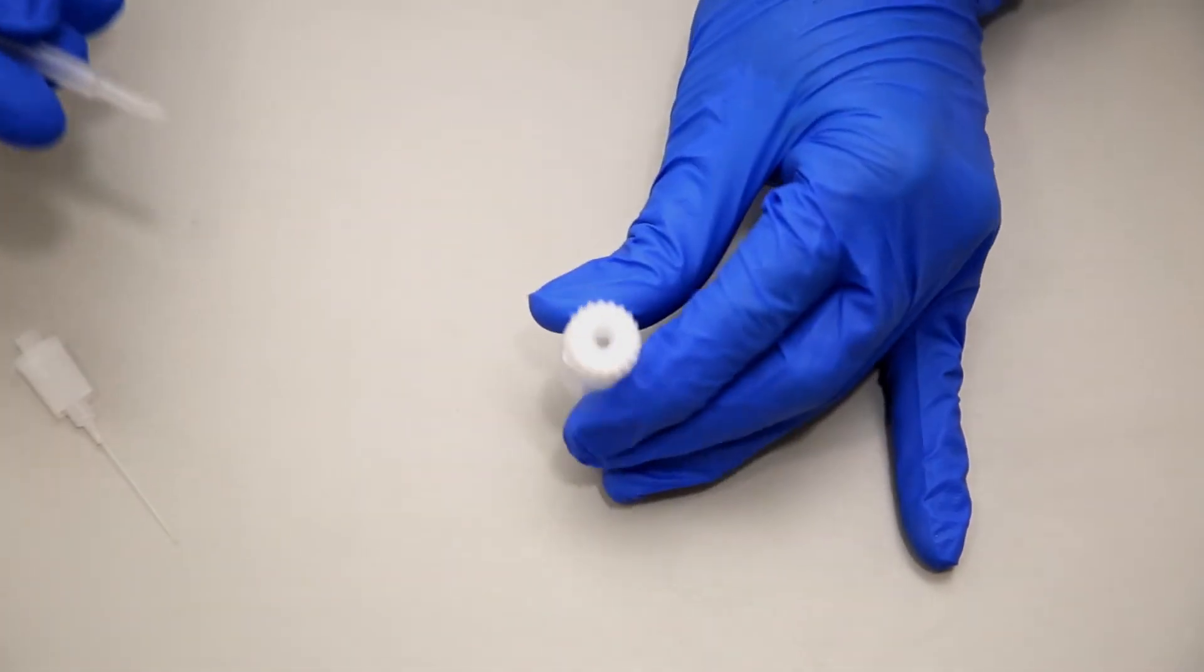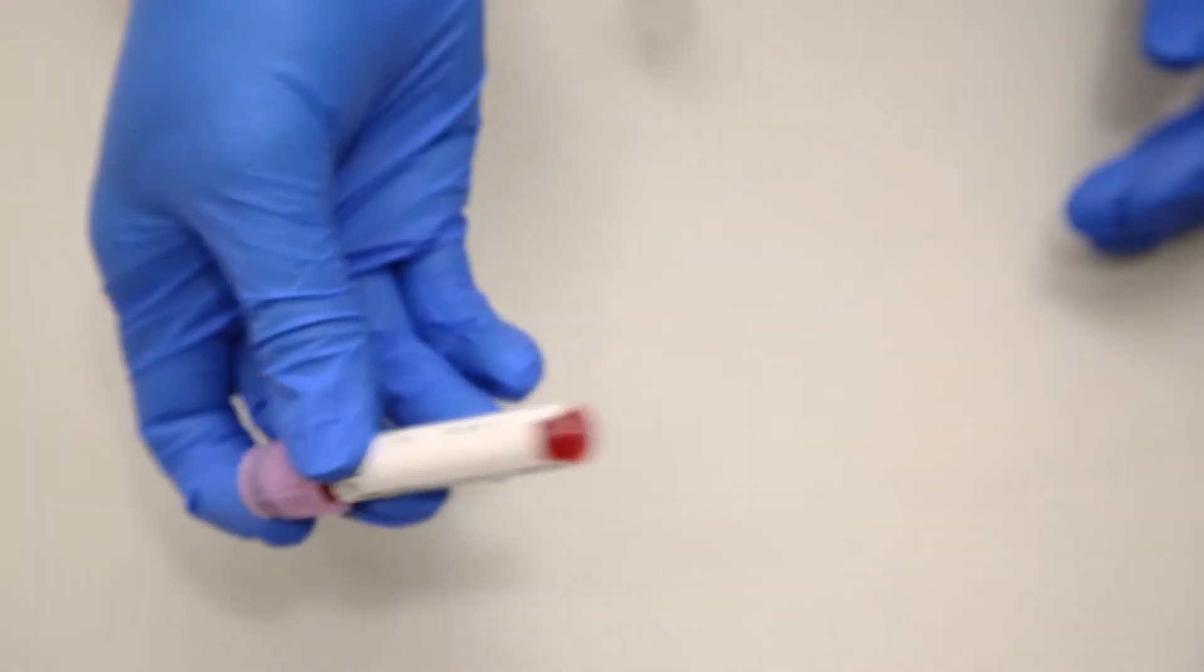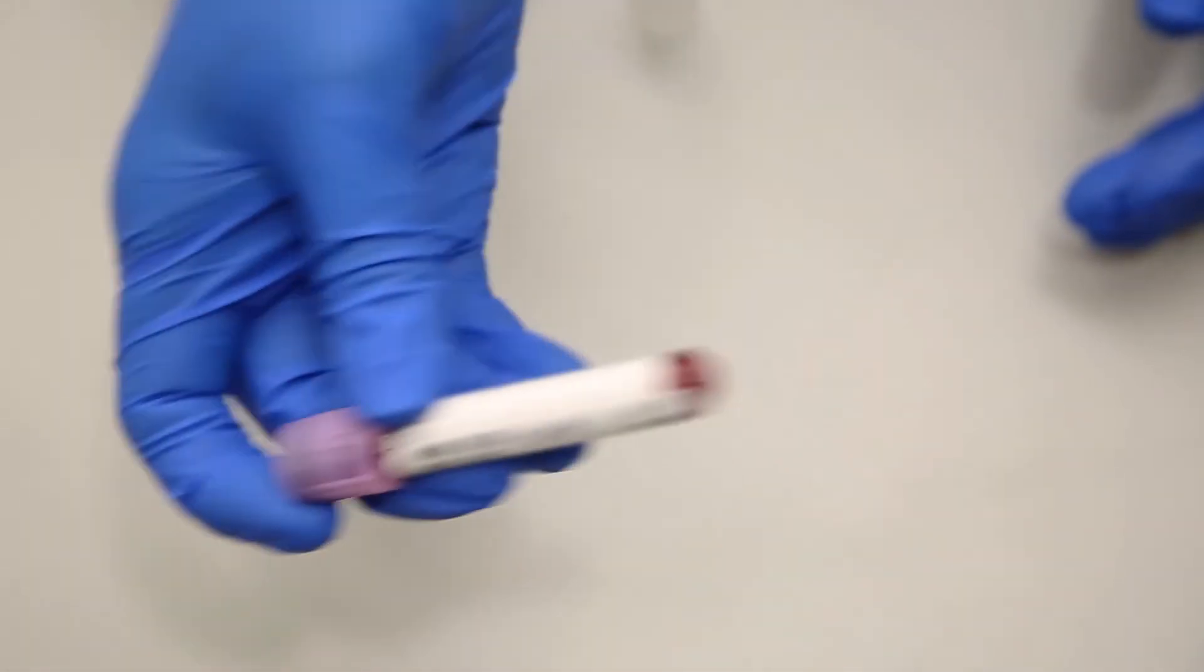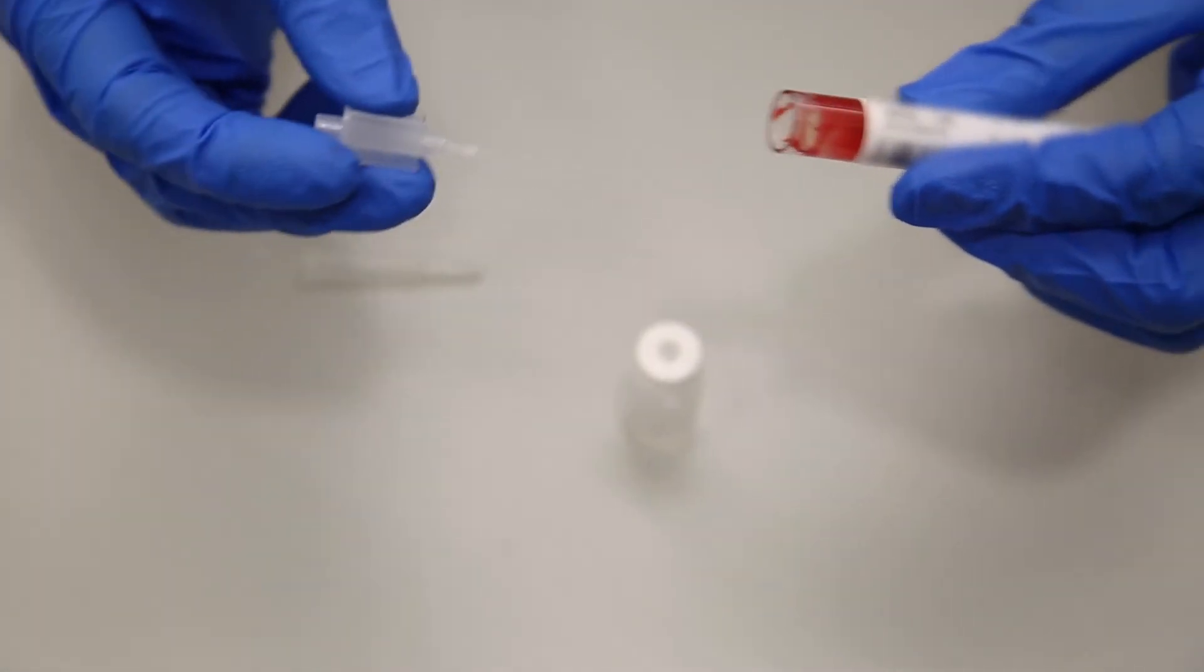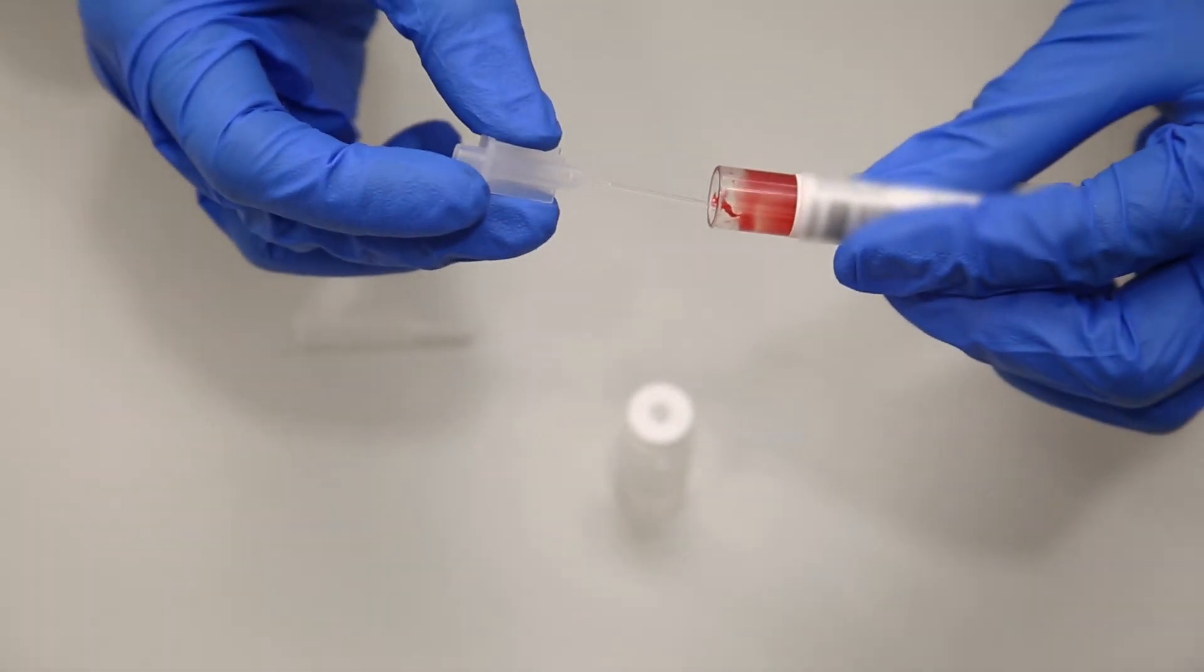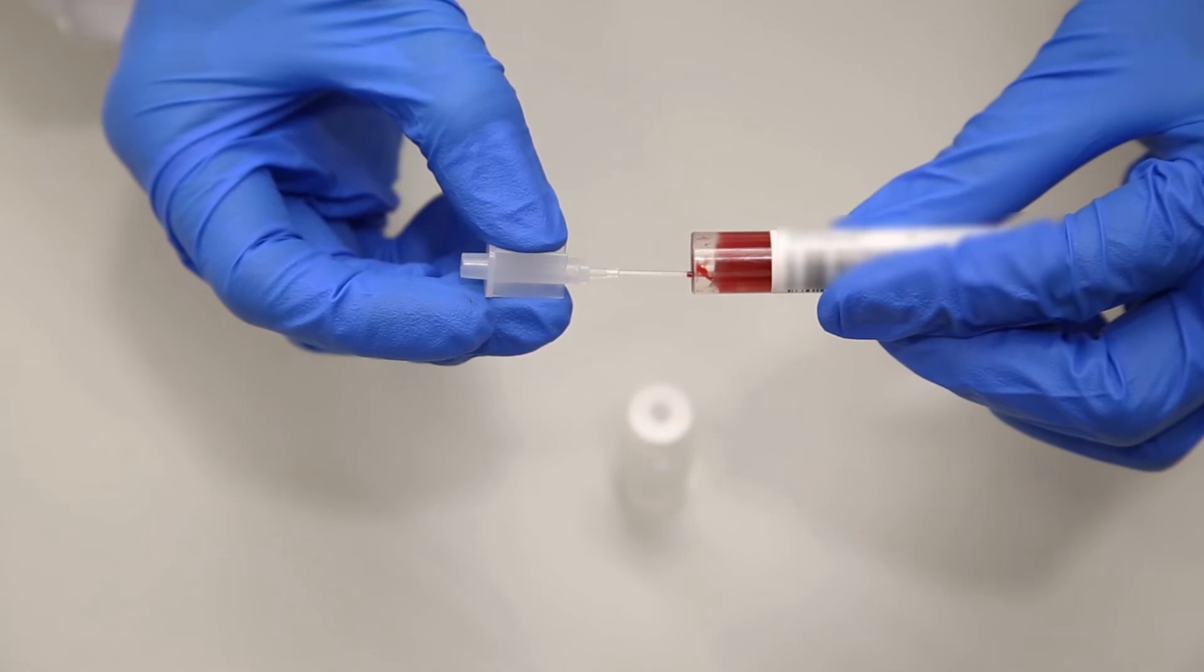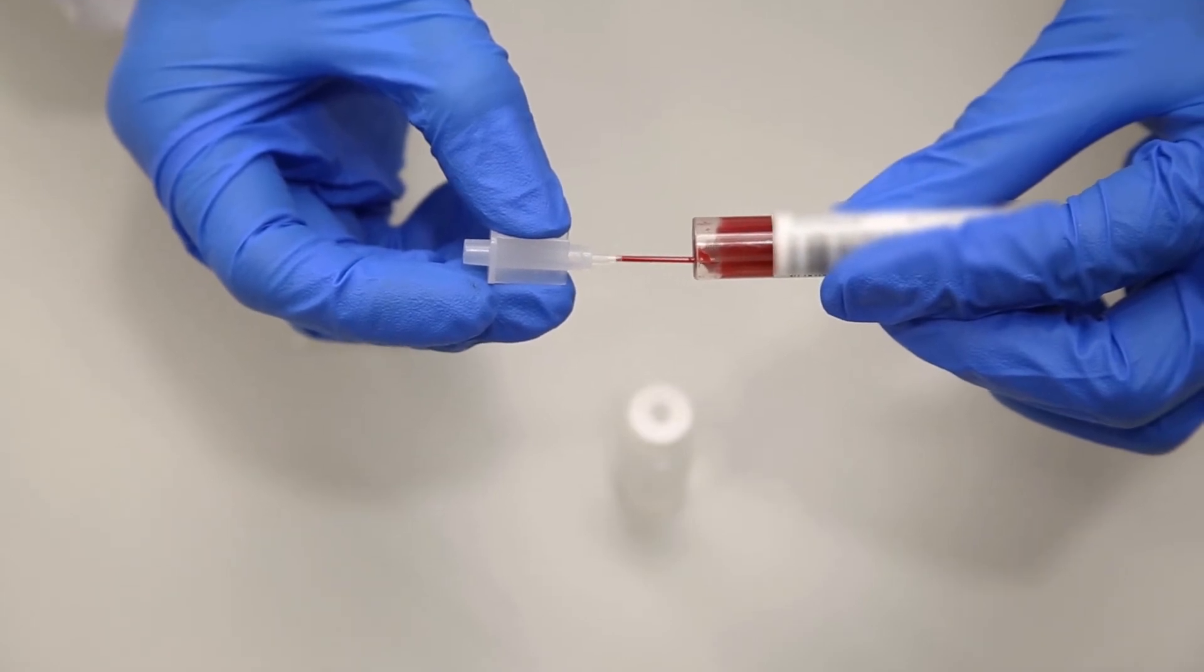Then remove the shield from the reservoir. Make sure to mix the specimen well before filling the pipet. Holding the pipet horizontally, touch the tip to the blood specimen and allow it to fill. This occurs automatically through capillary action.